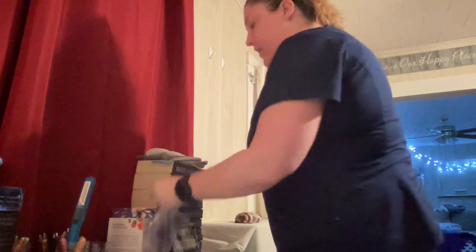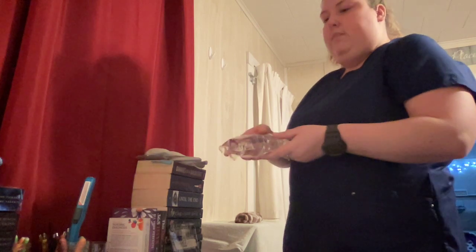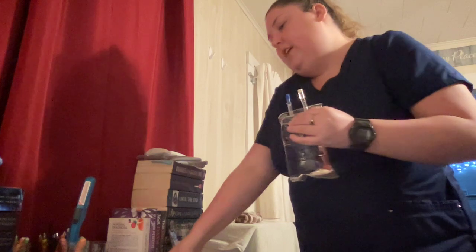I'm going to start with my primary fluid here. I have a trash can on the floor here. All right, my patient Ellen Davies, 919XX, 57 years old. That's who I have here. Your only allergen is pollen. I'm going to be giving you normal saline, 500 milliliters, compared to the MAR, normal saline, 500 milliliters. Again, I'm going to give that at a rate of 125 milliliters per hour.